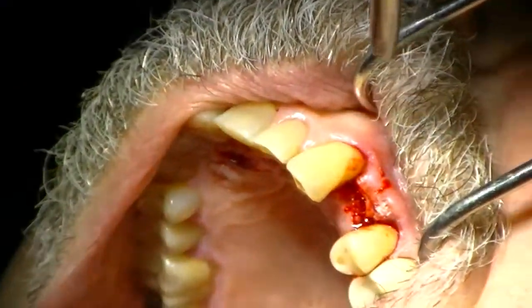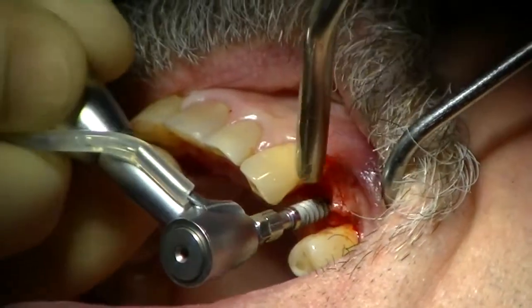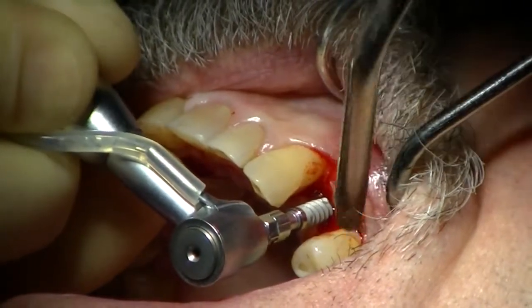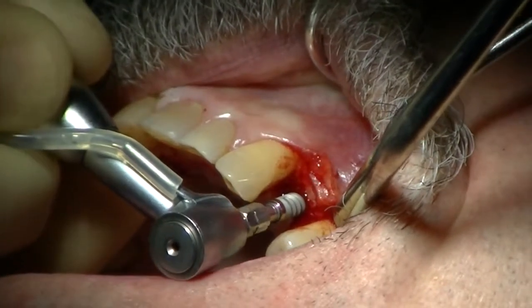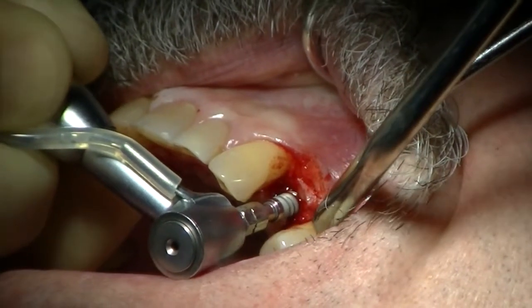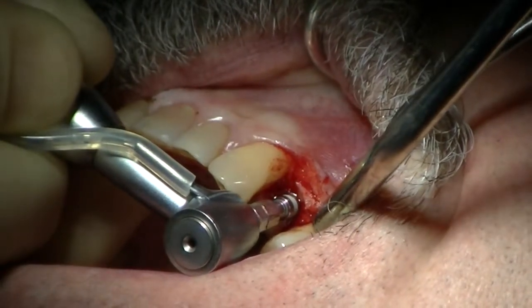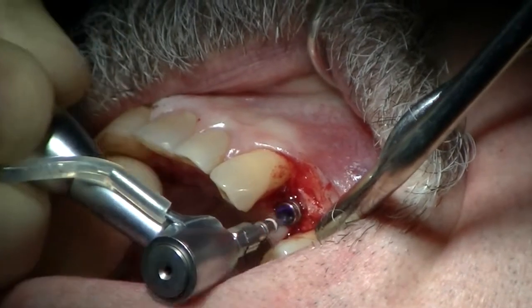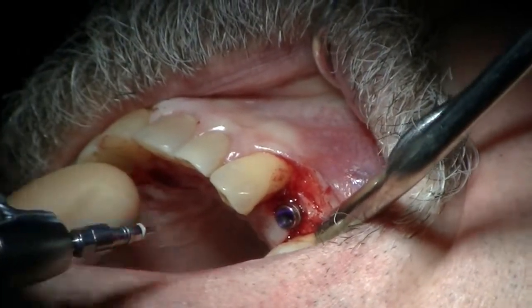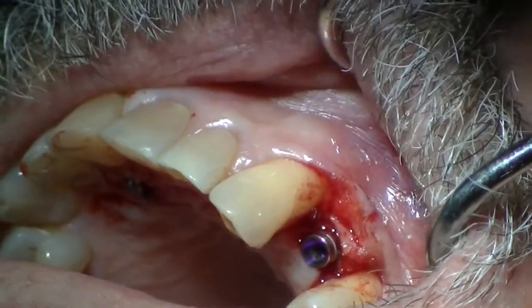Now I don't mind the red blood cells in this area, and I'm going to go ahead and simply place the implant very slowly. I'm watching it go in. And you heard that sound, so we're torquing out, but I'm not at depth yet. So what will we do next?